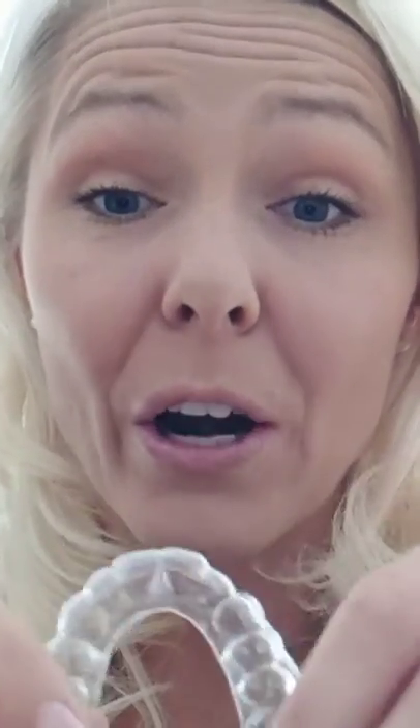And now I'm going to put in my tops. Oh my goodness — my teeth used to protrude. This one used to stick out far above the other one, and now look at them — they're the same. Super excited.